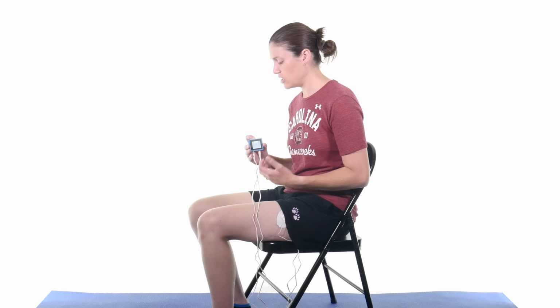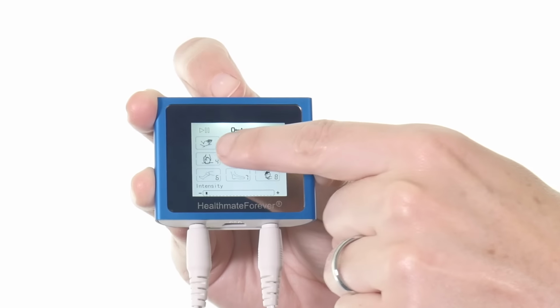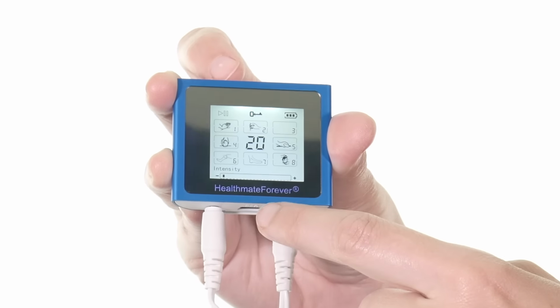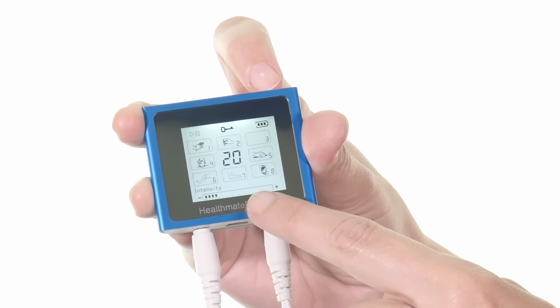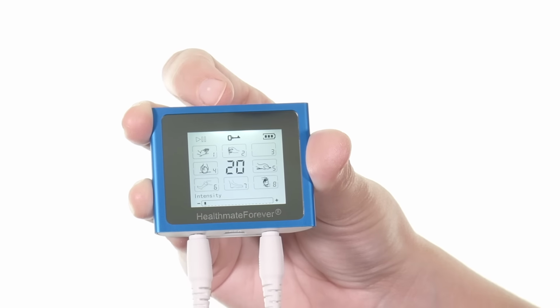So for TENS, you're really trying to decrease the pain, help increase that circulation. So you want it to be the most comfortable for you. There's no reason you should be sitting there going like this the whole time because it's uncomfortable or it doesn't feel good. So if you get it on and you're like, I don't like that setting, then you just hit the little M or the mode and it'll go to the next one. And then you just bump up the intensity with that. So if you get to one and you're like, ooh, that one is kind of a prickly one, then just move on to the next setting and add it on.